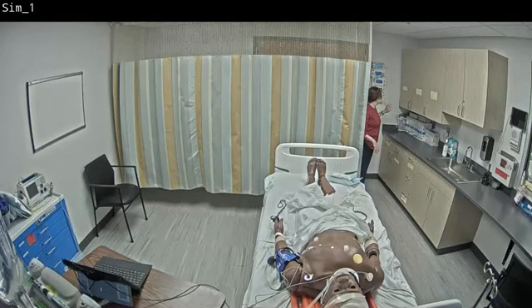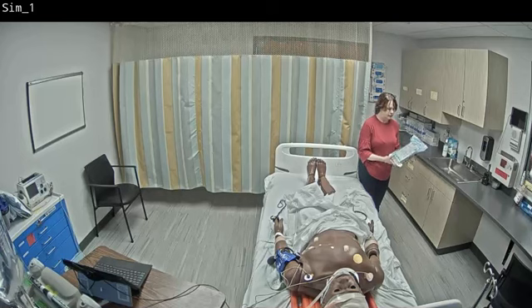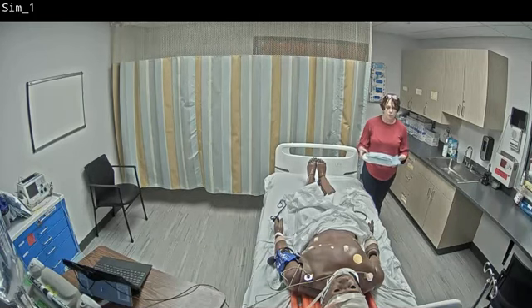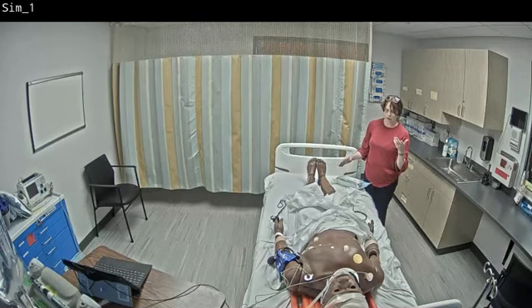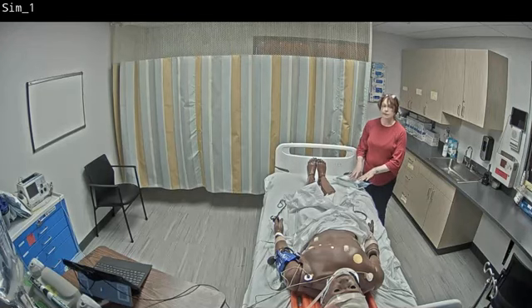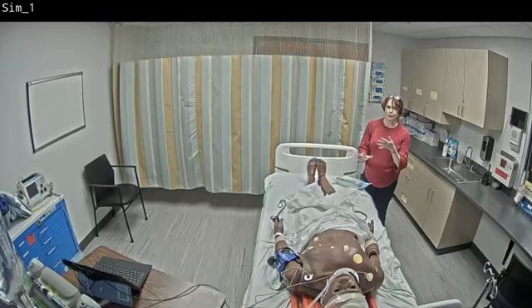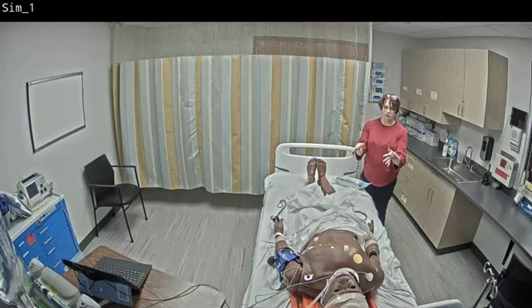With inserting the catheter, the kit itself is packaged to simulate what you would experience in the real world scenario. We open the pack and pull out the items that are harmful to our simulator. For example, the Betadine can stain our simulator, so we pull that out and dry the swabs. KY jelly we can't use on our simulators because it doesn't help you with inserting the tubes.